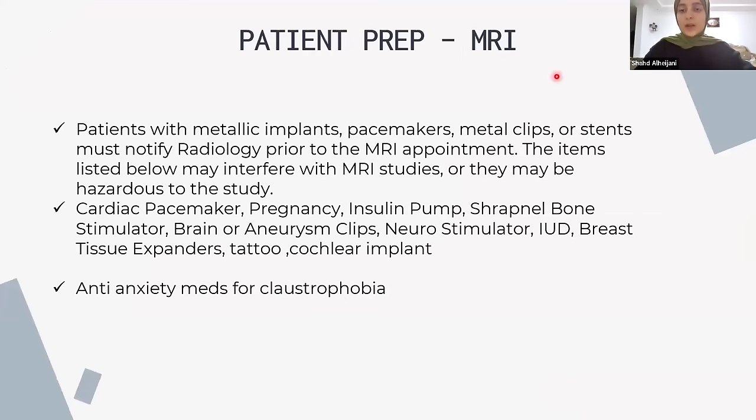So now moving on to MRI. You know the MRI machine I explained previously, where it uses the spin of the hydrogen atoms. It stands for magnetic resonance imaging, so it uses a magnet. One thing you need to keep in mind is that the patient should not have any metal. There are some other things you need to keep in mind, like if the patient is claustrophobic, the tight space and the loud sounds will affect them. But the main concern here is the metal.